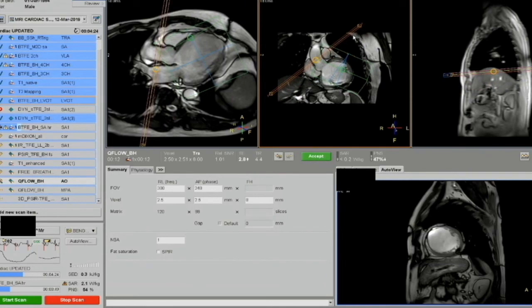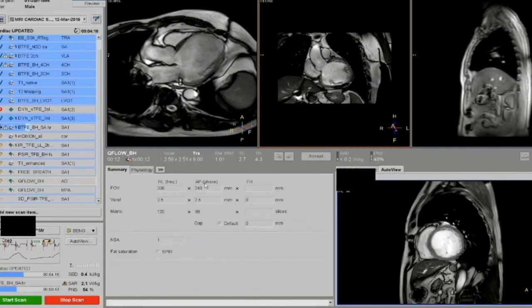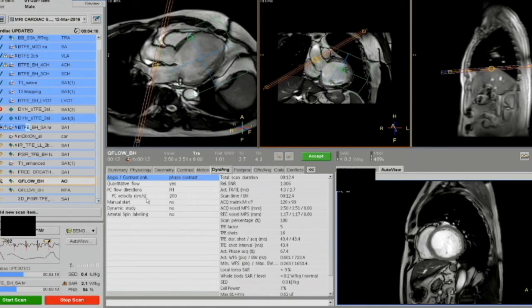The aortic flow is calculated by placing the imaging plane perpendicular to the ascending aorta in 3-chamber and LVOT views, just above the level of the sinotubular junction. Here, as you can see, the imaging plane is placed such that it cuts the ascending aorta so that the cross section of a circular aorta is obtained, which is ideal for calculation of volume.